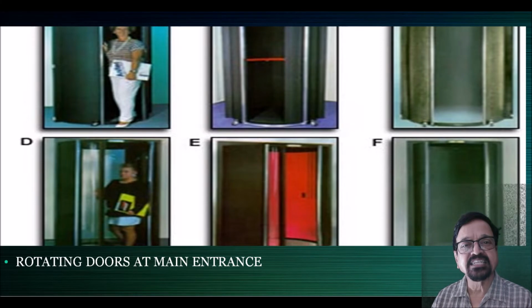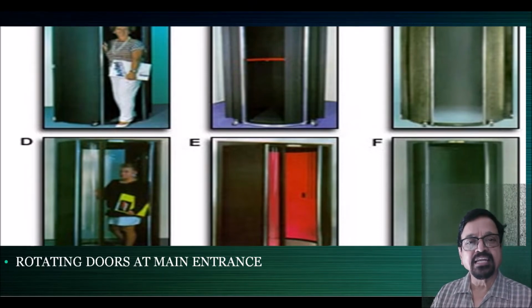In that C, the technician enters, and it rotates so that the open surface goes inside the darkroom, but the outside surface is covered and there will not be any seepage of light. This type of entrance is not very common in a busy department. The reason is it takes a long time. Instead, a pass box does a better job and is faster for a busy department.